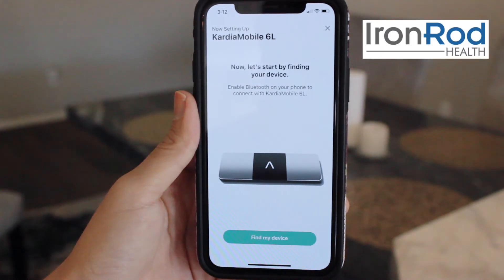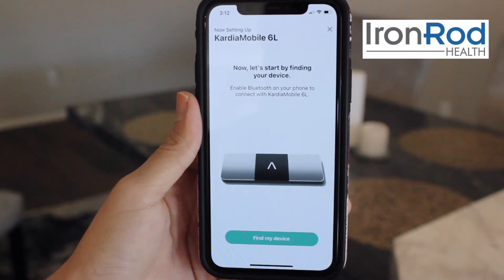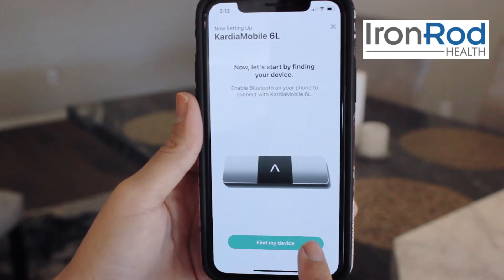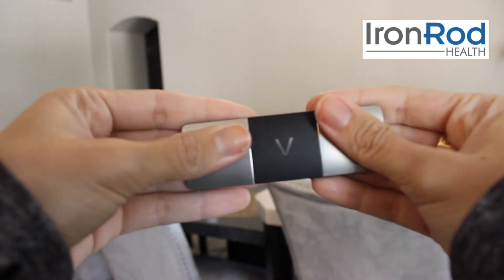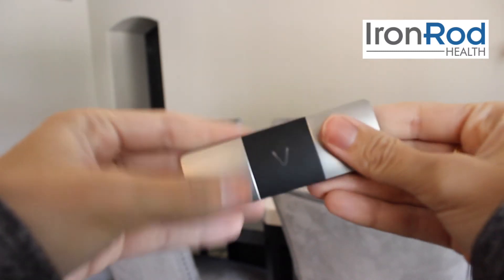Now, to finish pairing your device, we have to first turn it on. Press the button on the bottom of the page that says find my device. Then tap and press on the electrodes on your Cardia device. The electrodes are the two silver squares on the front of the Cardia device.